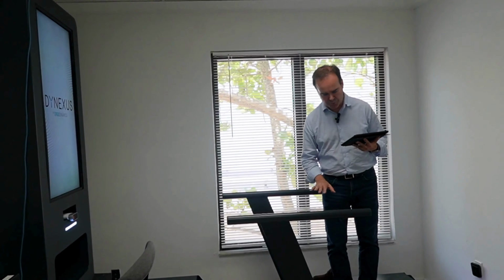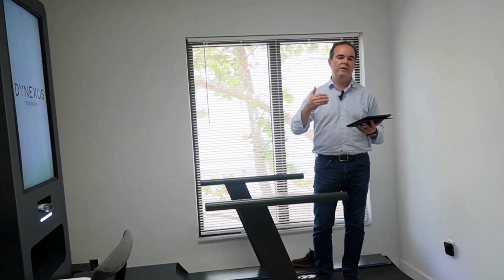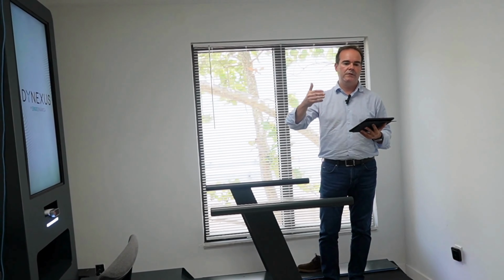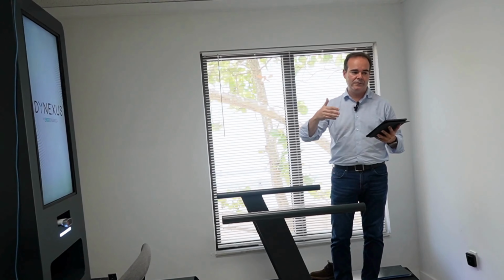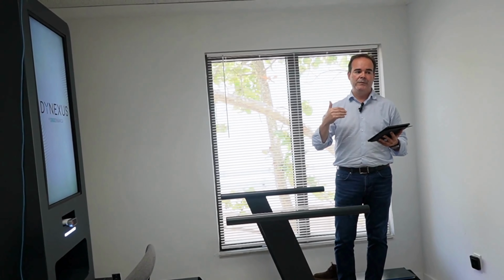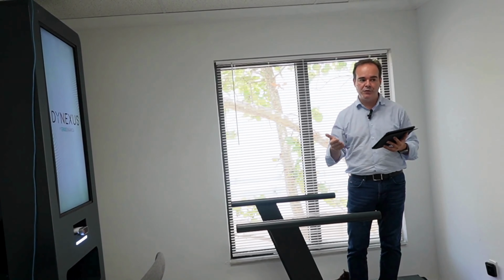Because one of the things we see is the flight time and the time that the foot is on the ground, and the instability they have, we can measure with 200 hertz per second, so it's very accurate. If we have a normal pattern before and we're doing a follow-up, because for example father or mother has this kind of neurodegenerative disease, then this could be an early diagnosis or an early finding. Of course, it's not an either-or.